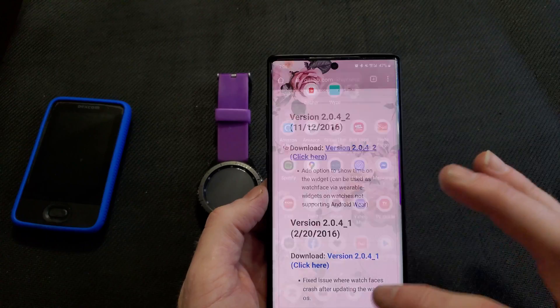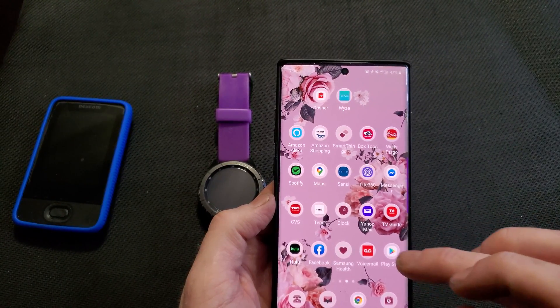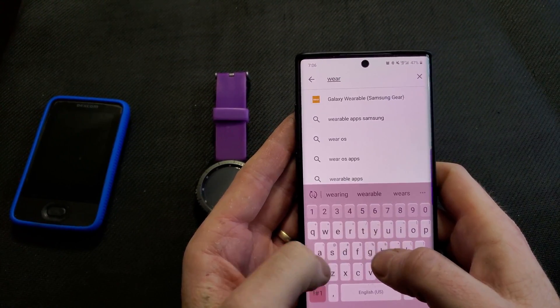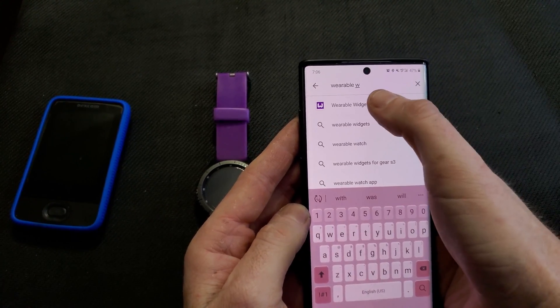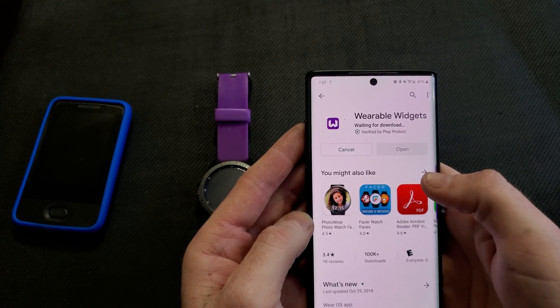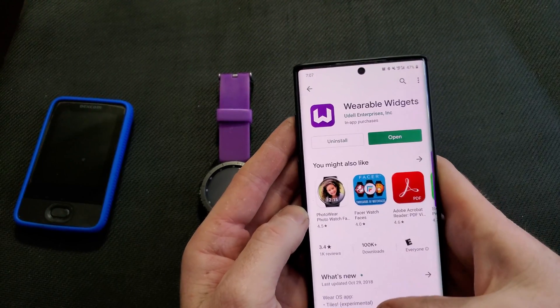All right, so that's done there. Now I'm going to go to the Play Store and download Wearable Widgets. I'm going to install that.